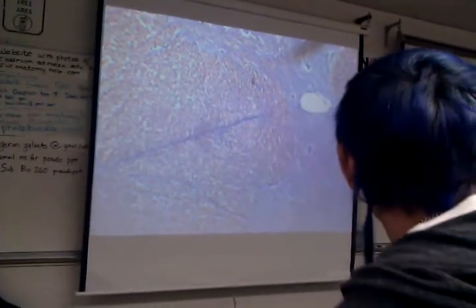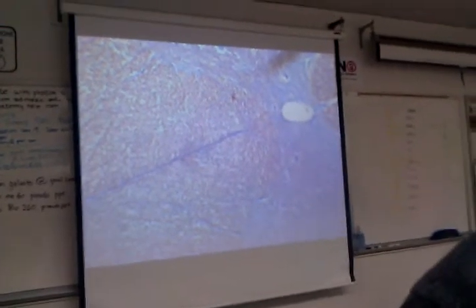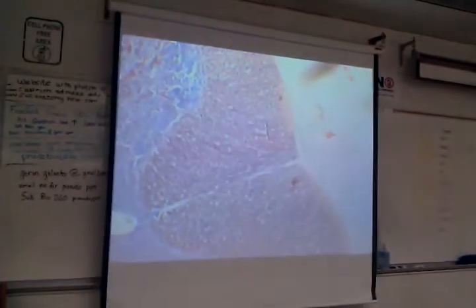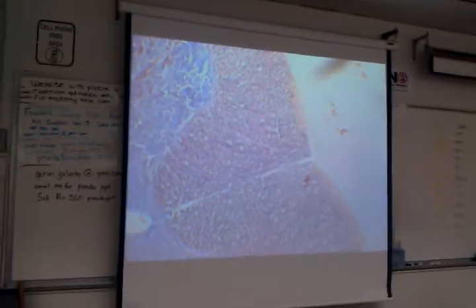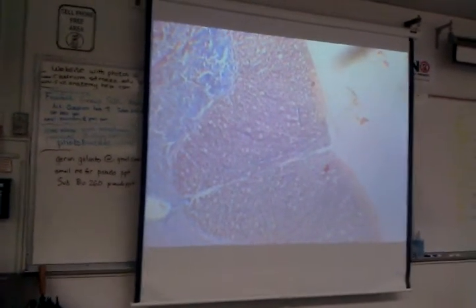I think right here. See this connection? Yeah. So here's the other butterfly wing right here. The little connection between the wings is called the gray commissure, and it's this area all in through here, and that's the central canal. The posterior sulcus is not very distinct on this one, but it's back here. Right? So that's kind of what you need to know about the cord.